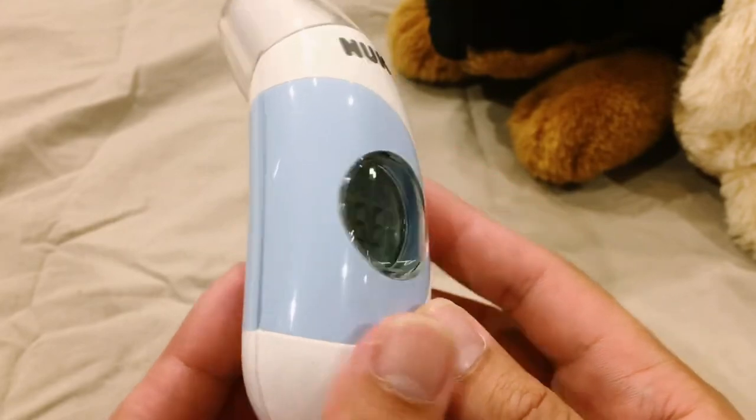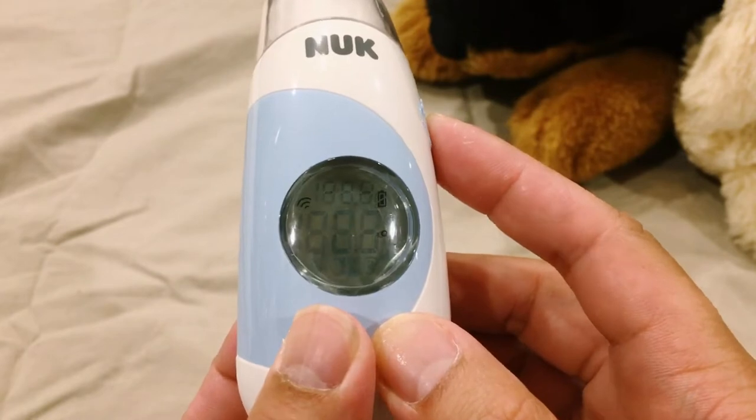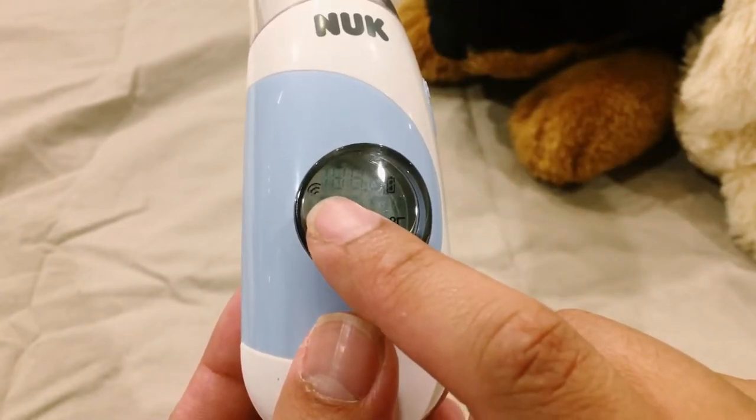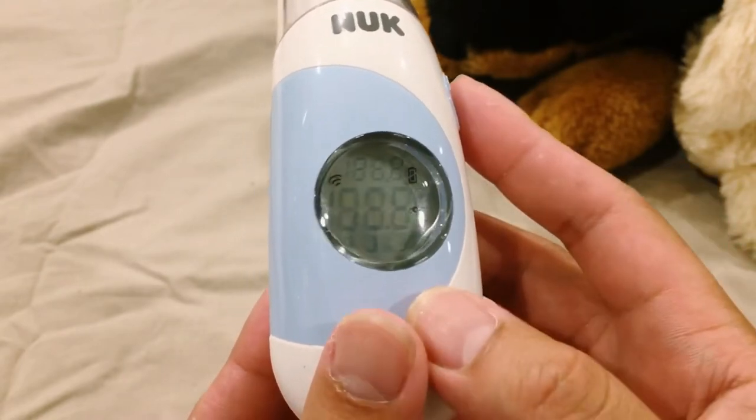Press the on and off button and the scan button at the same time until the WiFi symbol appears on the screen. This turns the thermometer into the surface temperature mode.